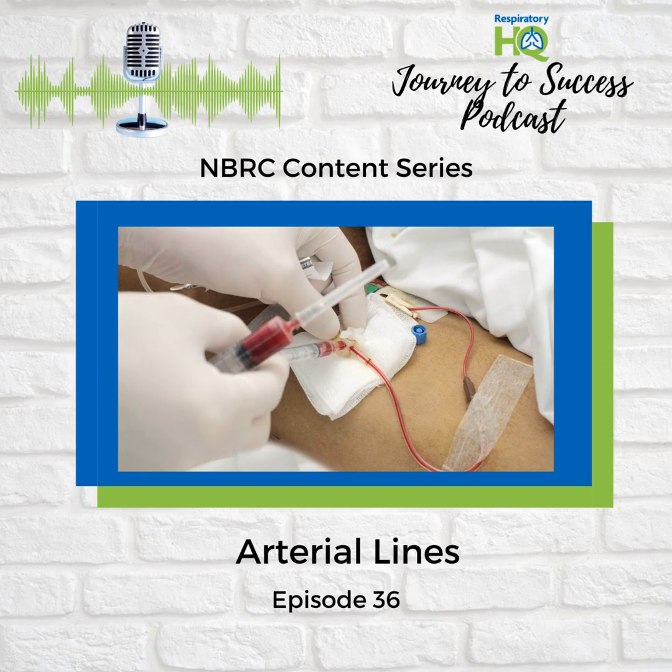That is a lot to think about. It seems like deciding to use an arterial line is a pretty big deal. It is, and that's why informed consent is so important. Patients really need to know all the potential downsides before making a decision. But the upsides, too. Oh, for sure. Like how precise the monitoring is. Arterial lines provide amazing info, allowing for super precise adjustments to meds or fluids. It's all about weighing those benefits against the risks. Like a high-stakes balancing act.